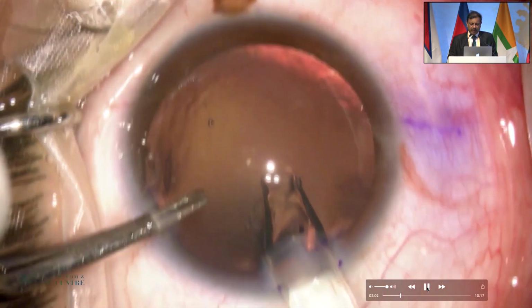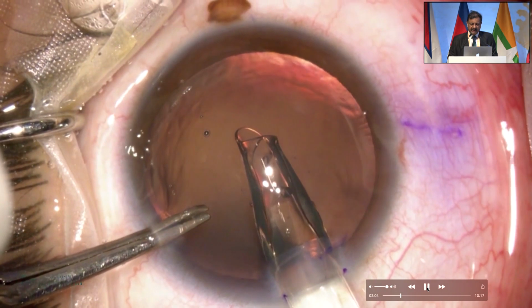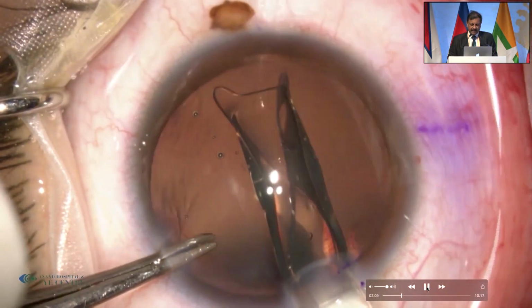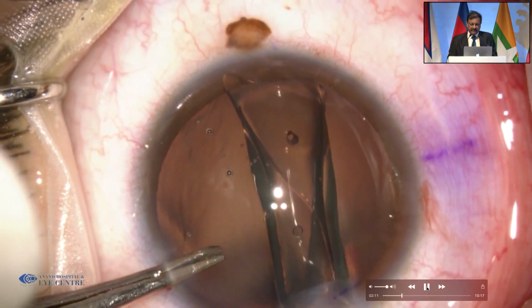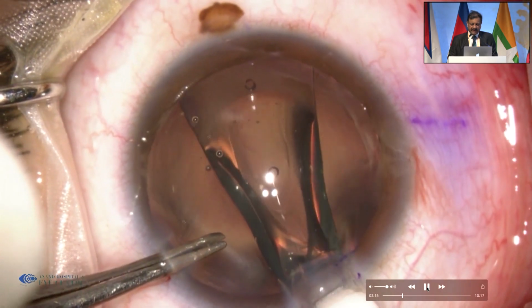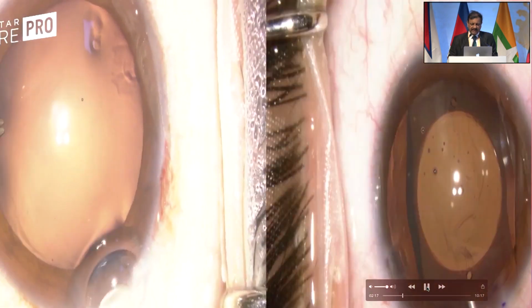So you have to observe how the leading part of the ICL goes inside the eye. Be very, very slow, be very gentle, let the lens unfold so that the maximum part of the lens goes inside and opens up.